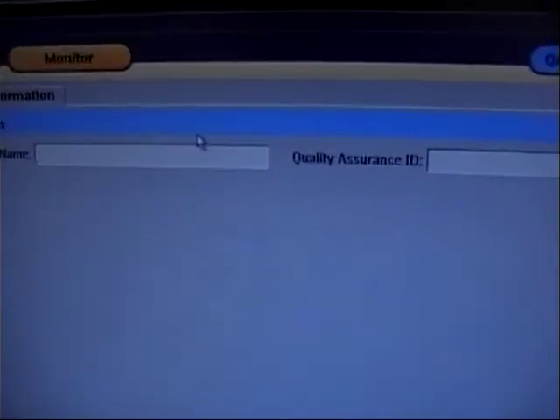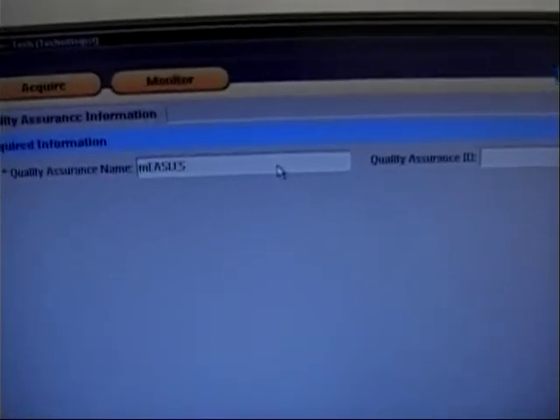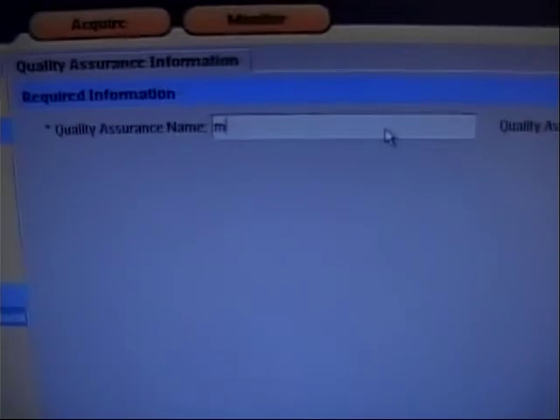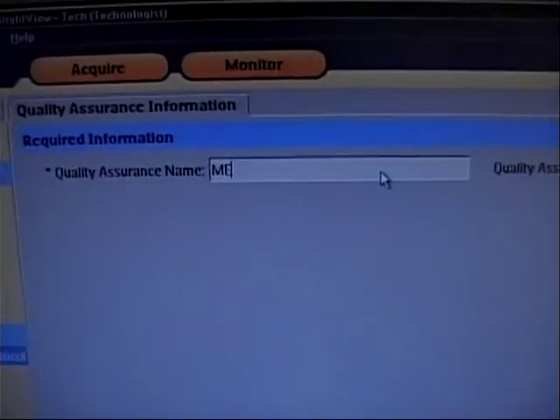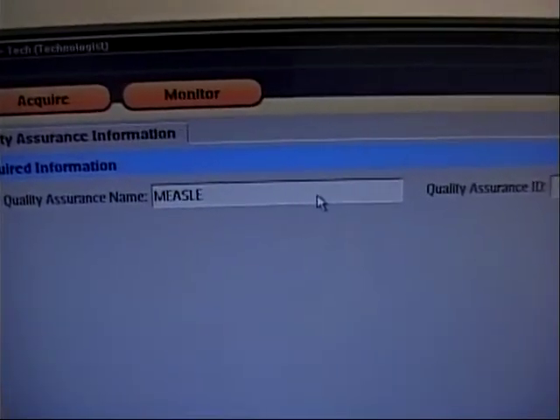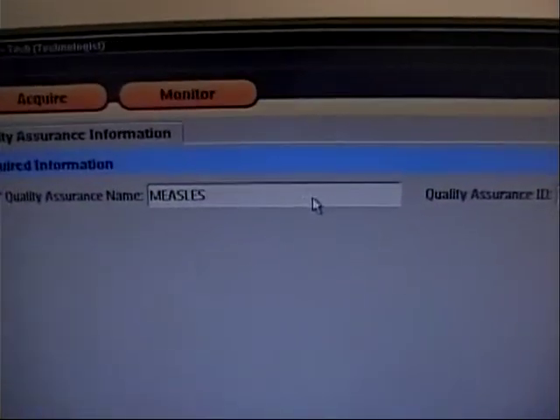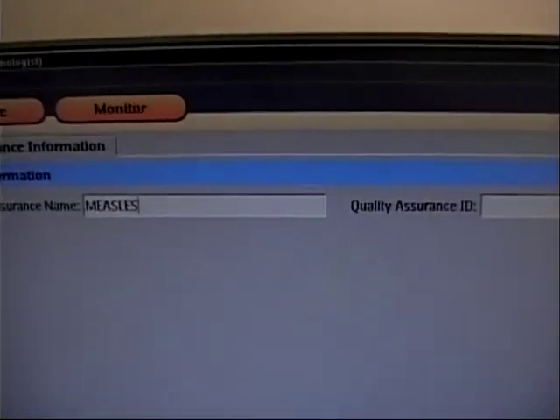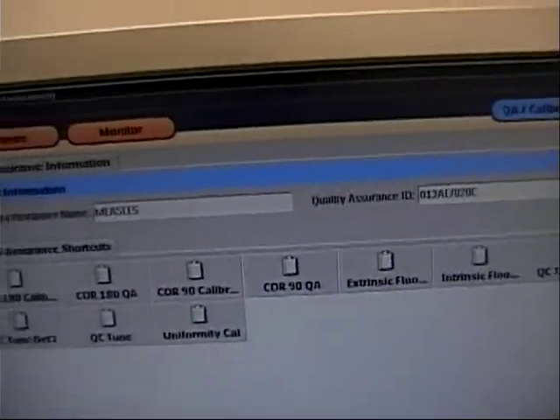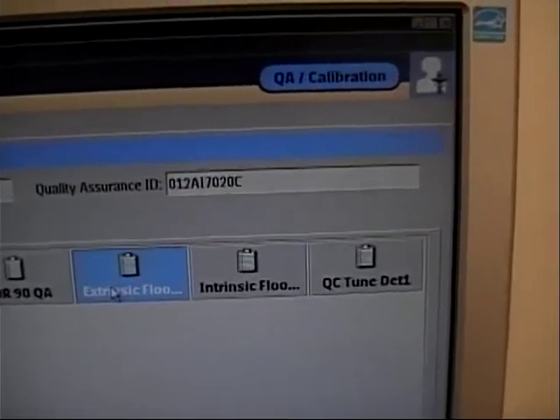acquisition station, and we're going to go ahead and set up this measles test. And I call it a measles test because you will find it commonly called measles on your flood when there is moisture that has become trapped on the actual crystal. And I'm going to give you a good example of that here in just a minute. So you go in just like you normally would.